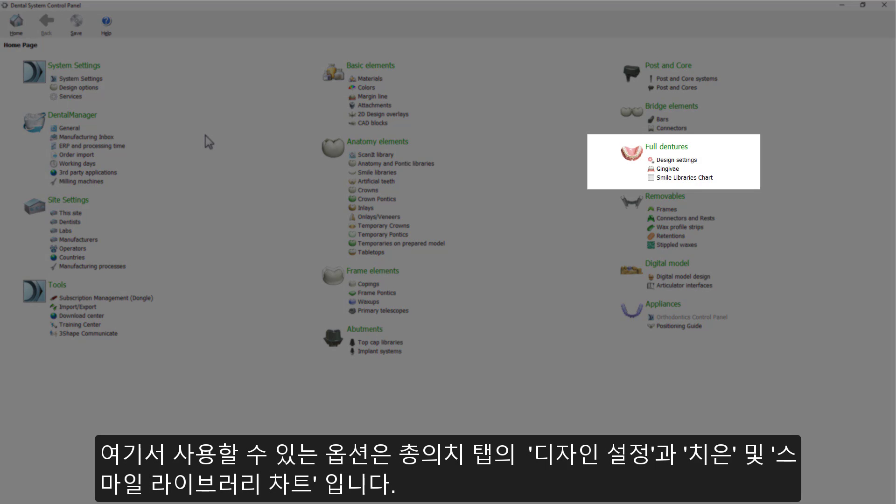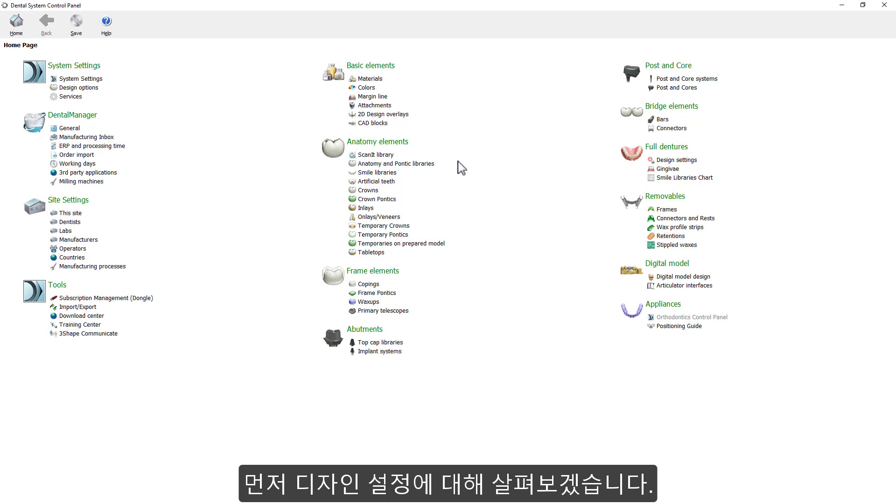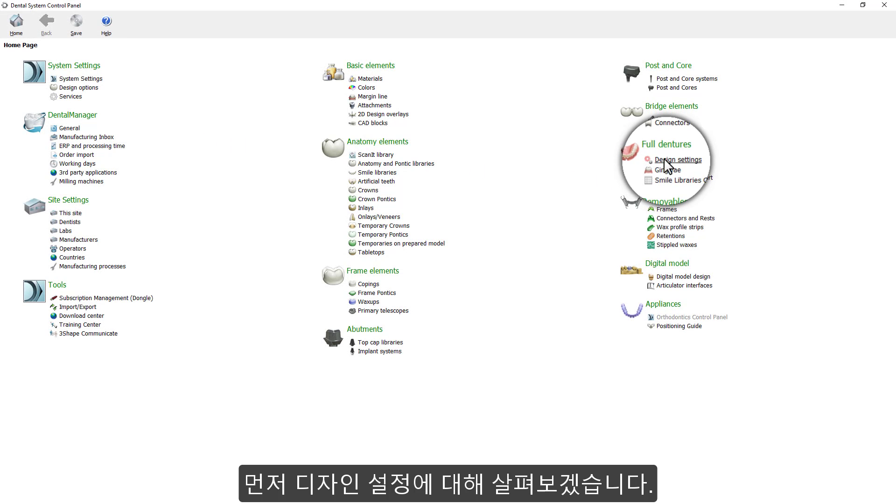Design Settings, Gingiva, and the Smile Libraries Chart. Let's start from the Design Settings.